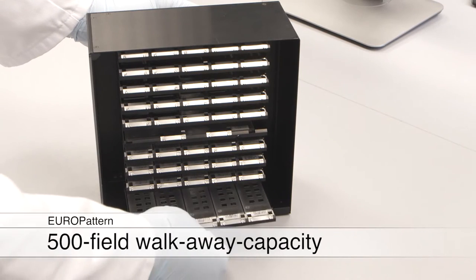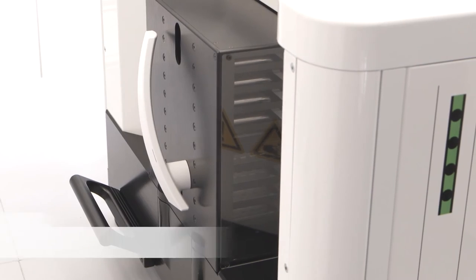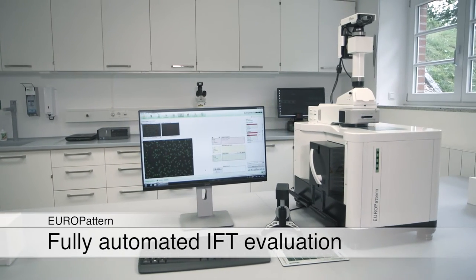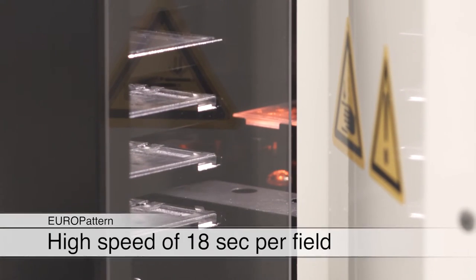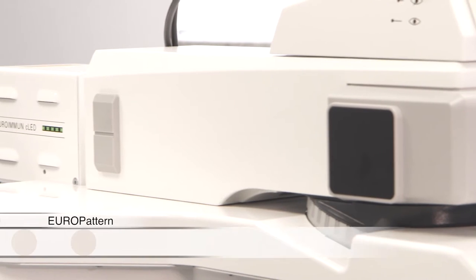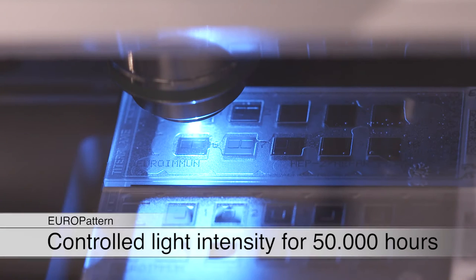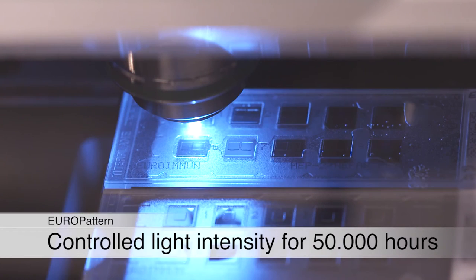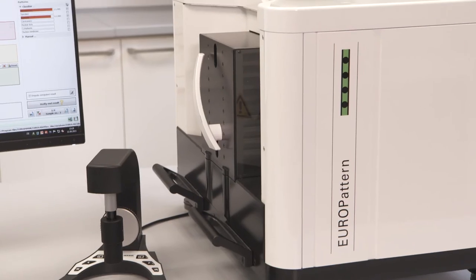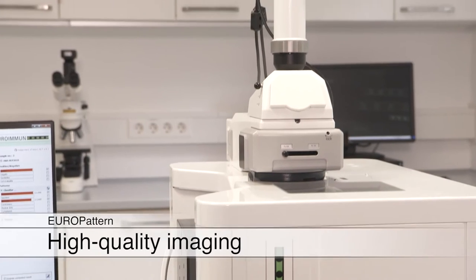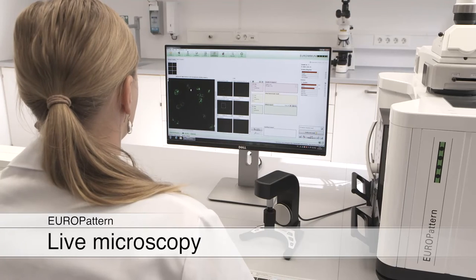For larger sample numbers, the object slides can be loaded into the EuroPattern microscope magazine which can carry up to 500 fields. Here they are automatically identified and microscoped. This procedure ensures complete traceability of results. The self-calibrating Euroimmune CLED guarantees a constant light intensity for over 50,000 hours of work. Vibration dampers, high quality optics and the double camera system provide for excellent image quality and highest speed of 18 seconds per field or 200 fields per hour respectively.